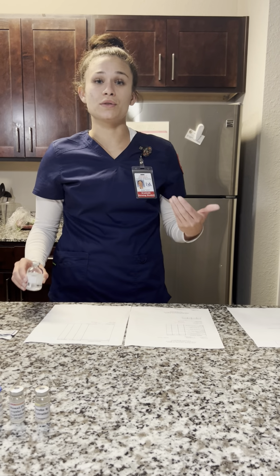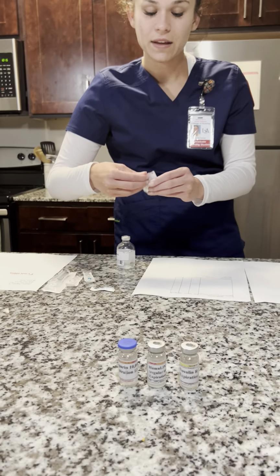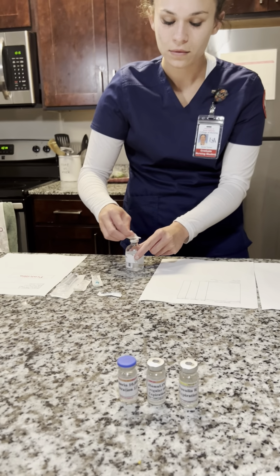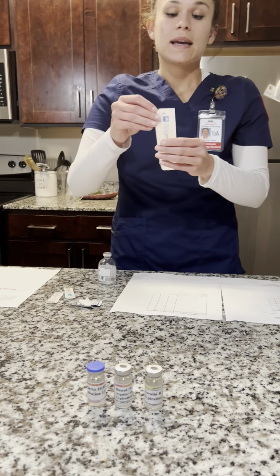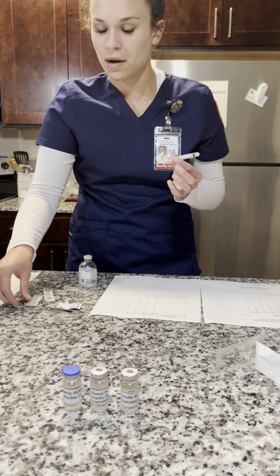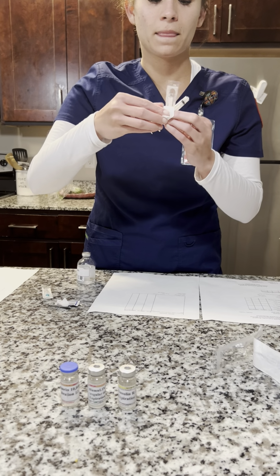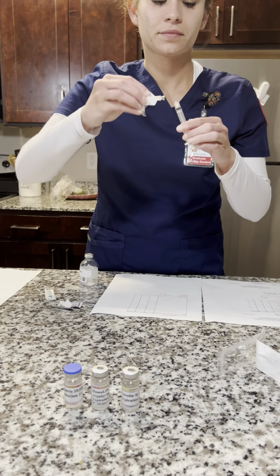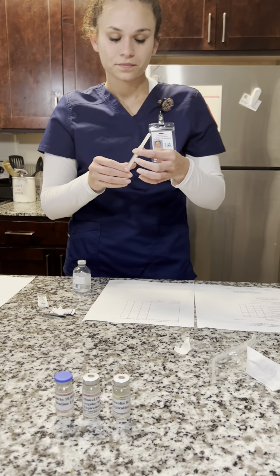So now I'm going to move on to drawing up my medication. I'm going to start by cleaning the top of the vial. Okay, I'm going to take out my syringe, take out my blunt plastic cannula, twisting that on tightly. Okay.